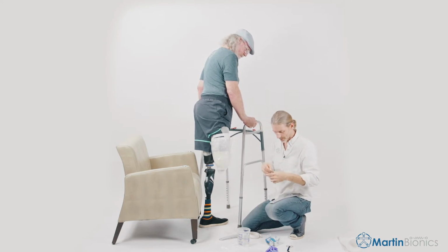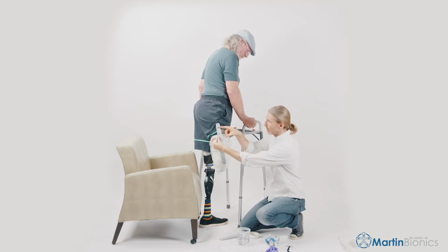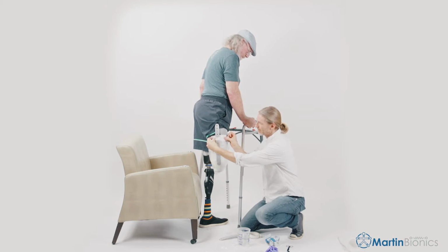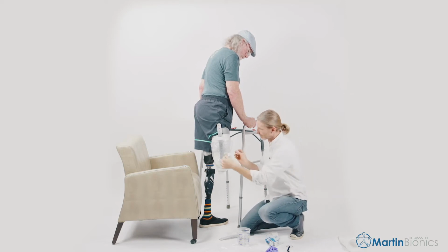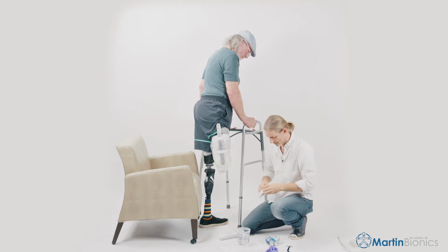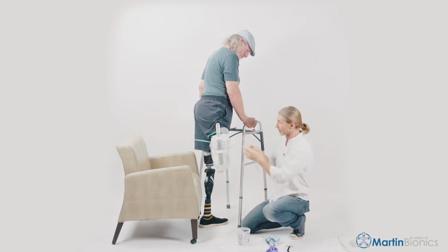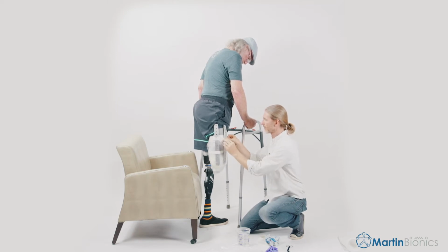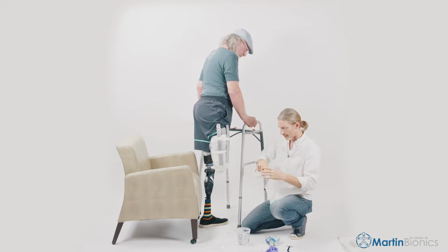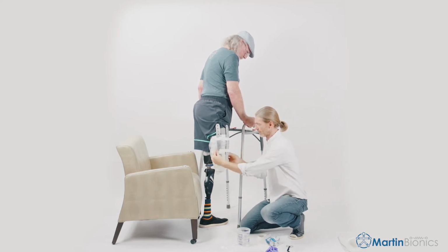These become the anchor points for the CX hybrid components. So just posterior to the trochanter, proximal about an inch, down the length of the limb, right about there. The swing brim will suspend from these struts. So think of this like the palm trees that the hammock is going to suspend from. And if you can imagine the lateral wall of a conventional socket, this is creating that lateral wall. Right.